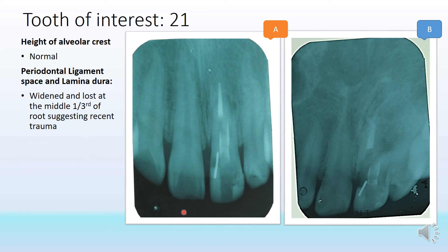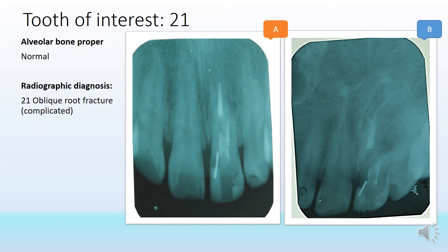The height of the alveolar crest appears largely normal. The PDL and lamina dura are somewhat confusing in the fracture area — since the fracture is extending onto the root, there is disturbance of the lamina dura and PDL, with widening and loss in the middle one-third of the root, suggestive of recent trauma as the area appears discontinuous.